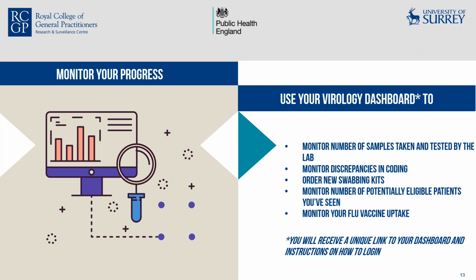I had another session this afternoon where a practice mentioned that they prepare their kits in advance and place the swabs and packaging materials all into the envelope. So when they see an eligible patient, all they need to do is grab the viral transport medium, print off the swabbing form, and package and send. So if you do have any ideas or steps that you've taken to incorporate this study into your workflow, please do let me know, and I will share it with all practices.